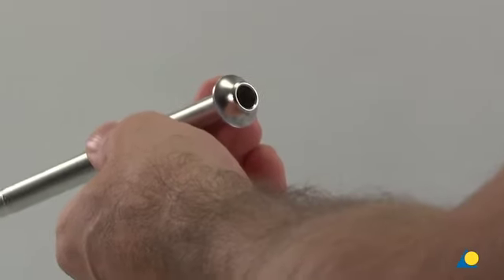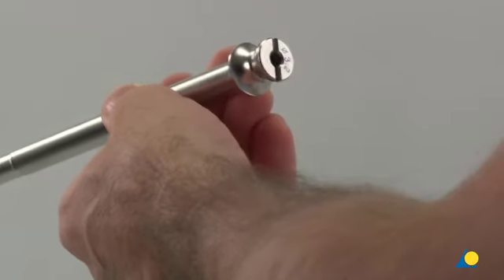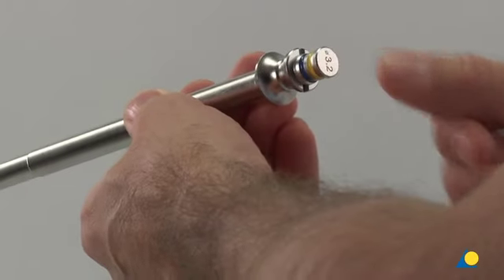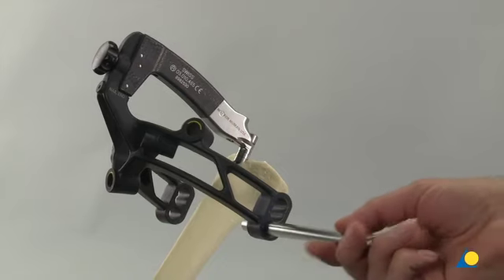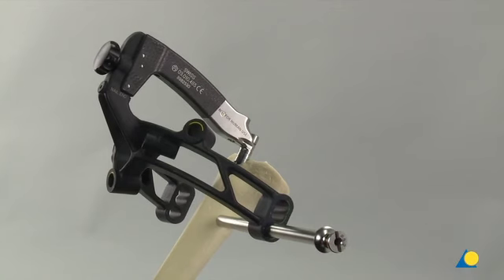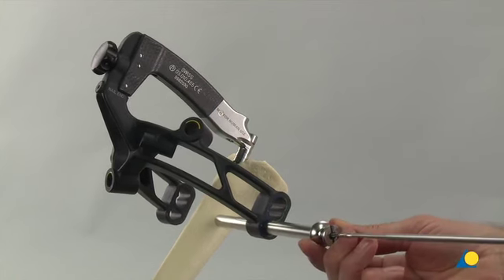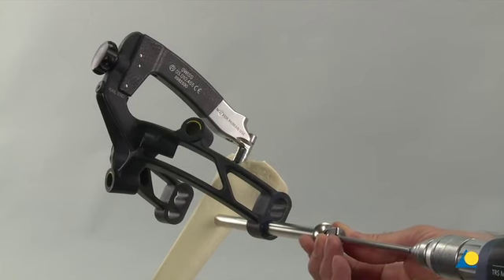The 3-part trocar combination, which consists of the protection sleeve, drill sleeve, and trocar, is assembled. It is then inserted through the hole in the aiming arm marked Stat 1, through a stab incision, down to the surface of the bone. The trocar is removed. While ensuring that the drill sleeve is pressed firmly to the near cortex, a 3.2 mm hole is drilled through both cortices until the drill bit just penetrates the far cortex.